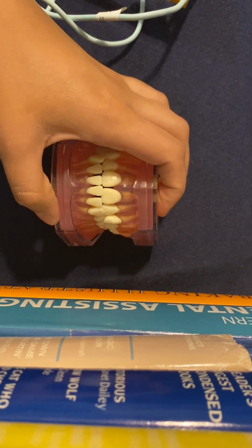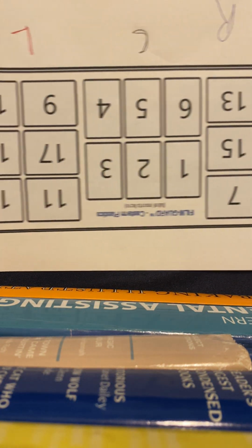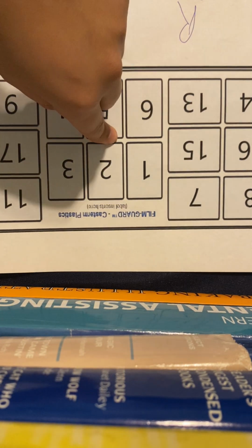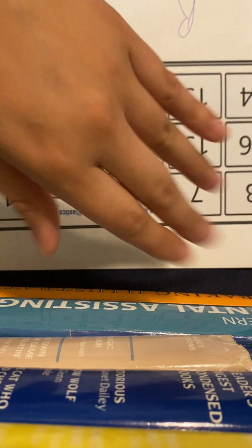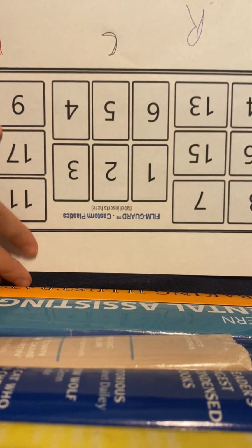Alright, so number 1, here's a sheet sequence. I don't know if that's important. So we're gonna start and we're gonna go in the order that they want us to, and we're gonna talk about receptor placement. We're gonna talk about the teeth you're gonna want to see, and you're gonna want to point your PID, your tube head. Whoop, that came off a little bit. So let's get started, shall we?